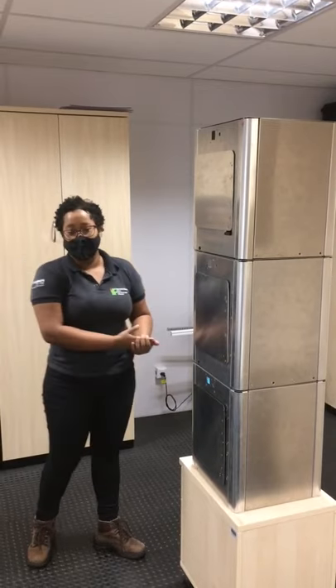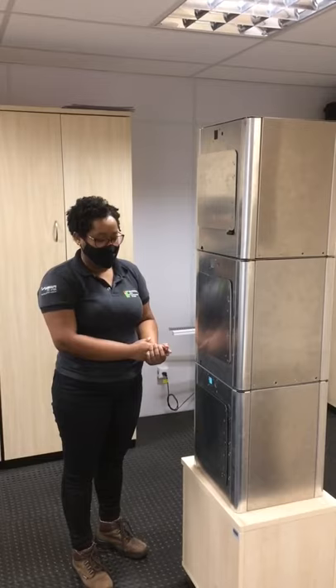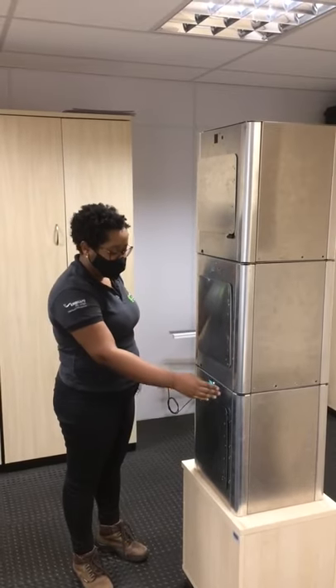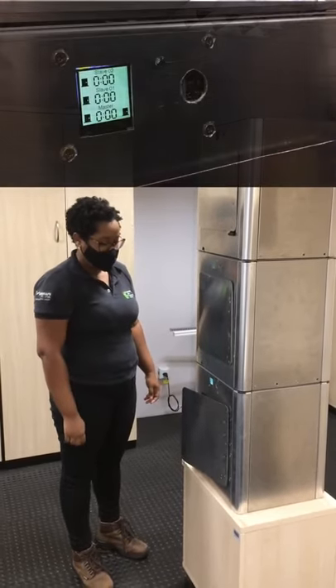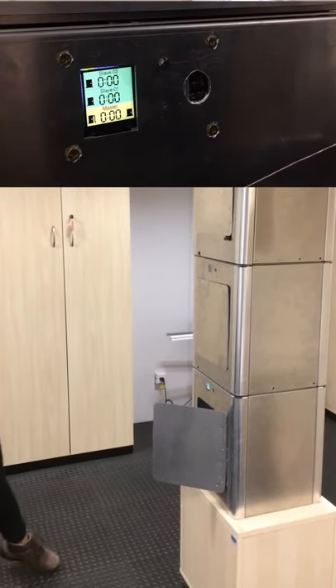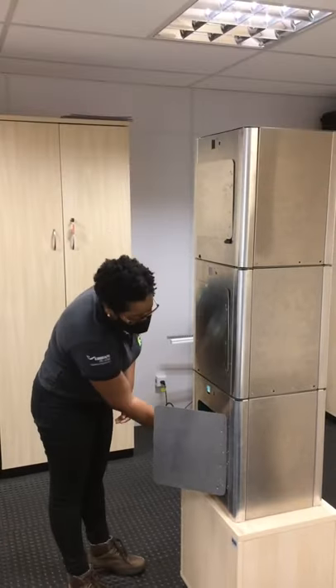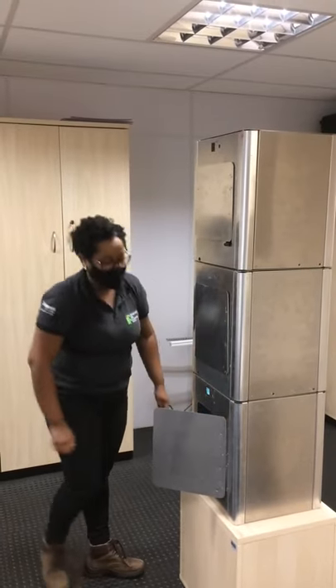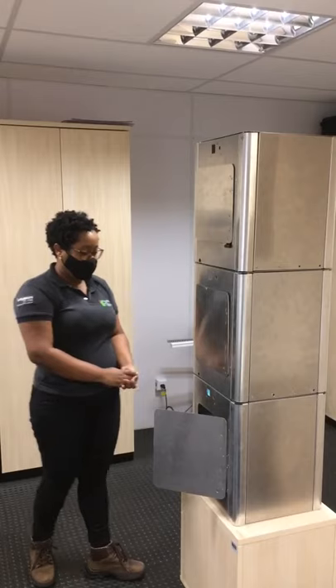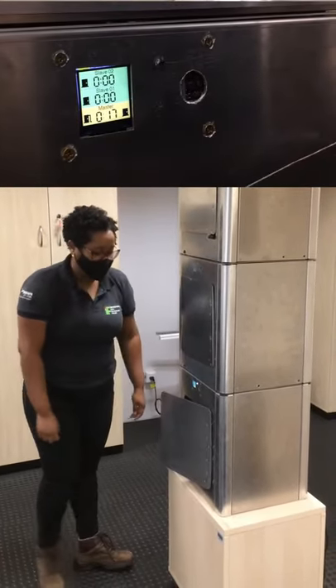Vou fazer a primeira esterilização do mestre para demonstrar. Vou fazer a abertura da porta com o gesto para a direita. Para exemplificar, a gente vai usar uma caneca. Vou colocar para esterilizar, entrando pela porta de entrada de material contaminado.